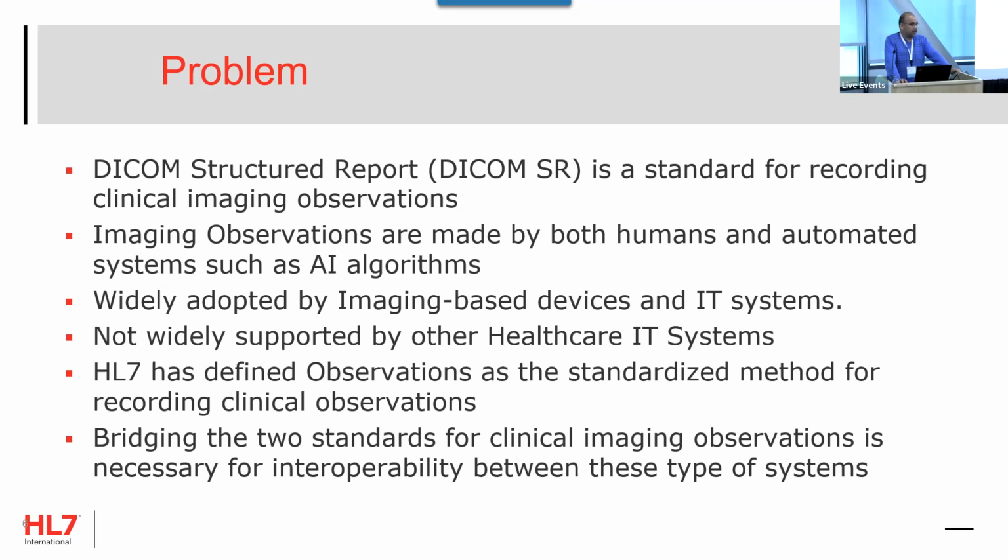But we think that it's important to utilize HL7 for interoperability. And we want to highlight the observation resource, as we think that for our purpose, it's the most appropriate resource.